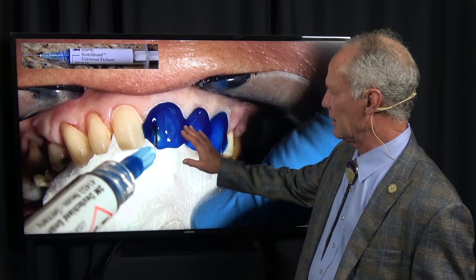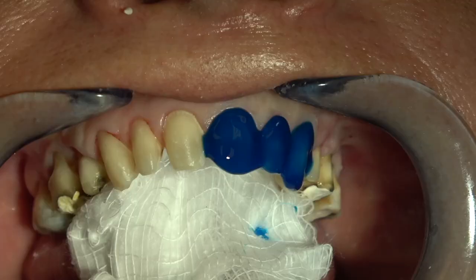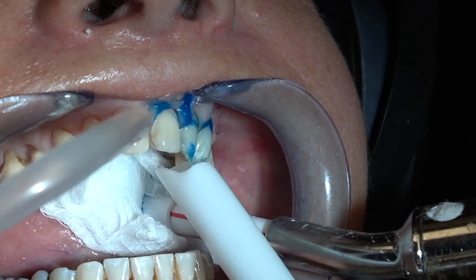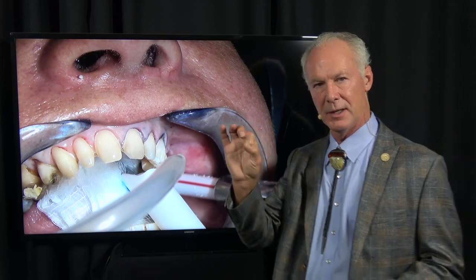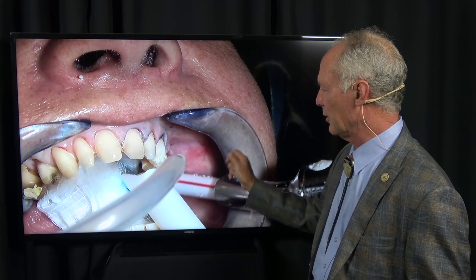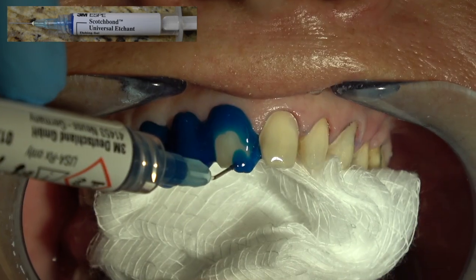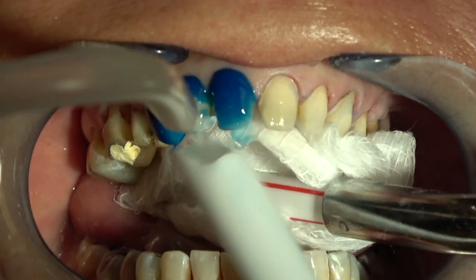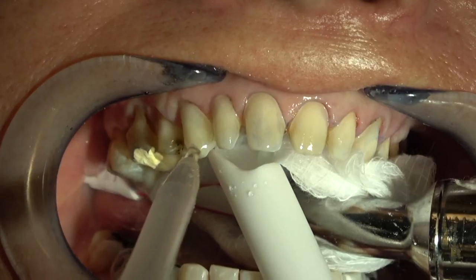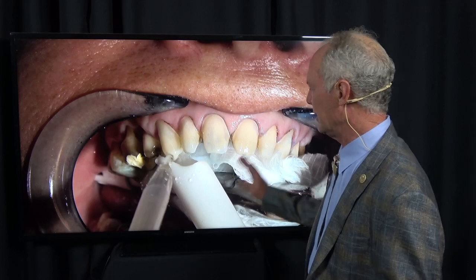By accident, I discovered that 38% phosphoric acid is a fabulous hemostatic agent. If you need to control gingival bleeding, place the 38% phosphoric acid on the bleeding area for 45 seconds. If there's a lot of gingival bleeding, you may have to do it twice. It doesn't affect enamel. For dentin, don't put 38% phosphoric acid on for more than about 15-20 seconds. It causes bleeding areas to scab - it's better than anything I've ever found for hemostasis.